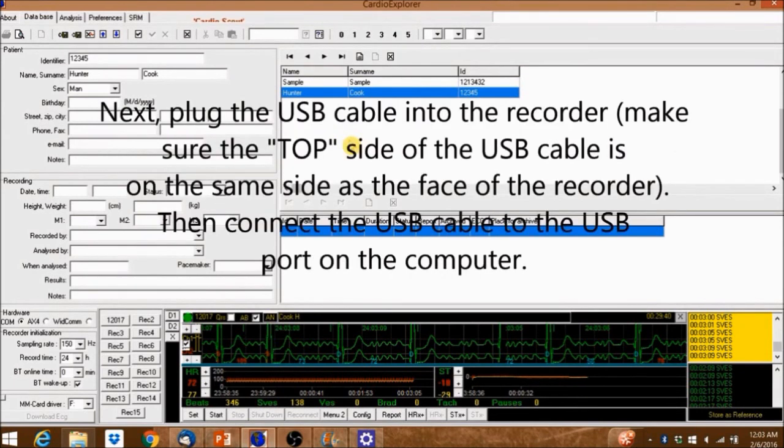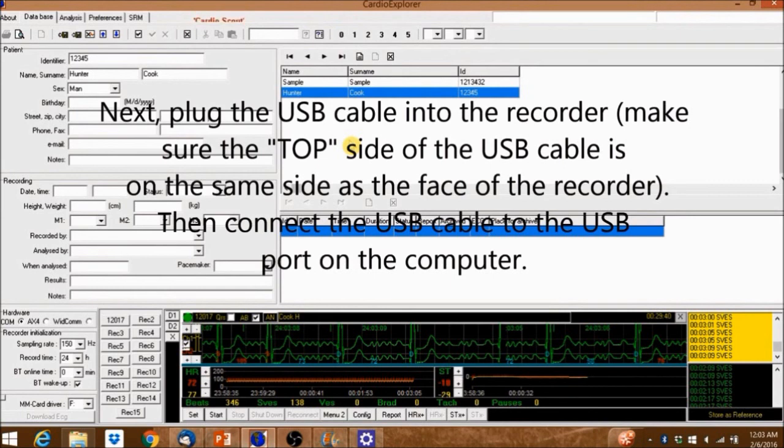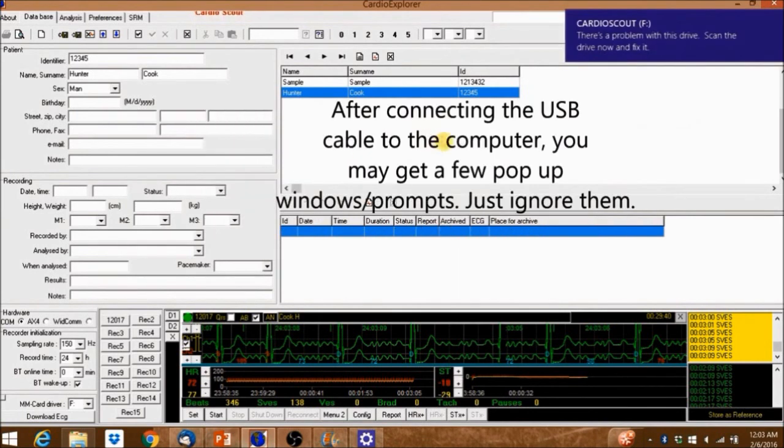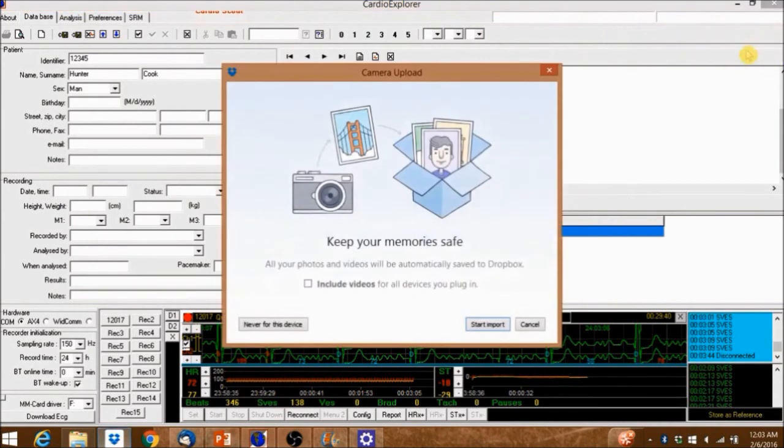Next plug the USB cable into the recorder making sure the top side of the USB cable is on the same side as the face of the recorder. Then plug the USB cable in. After connecting the USB cable to the computer you may get a few pop-up windows or prompts. Just ignore them.